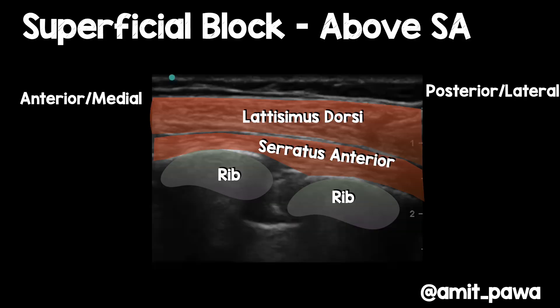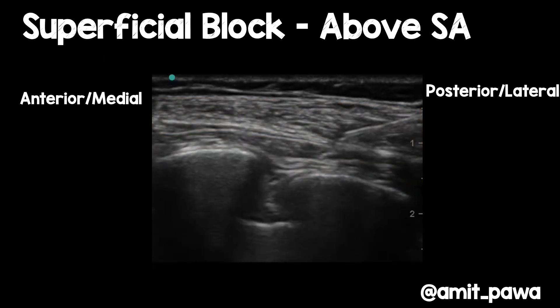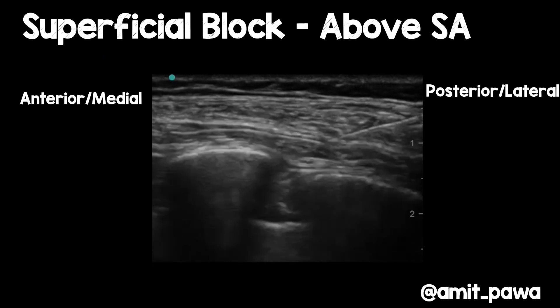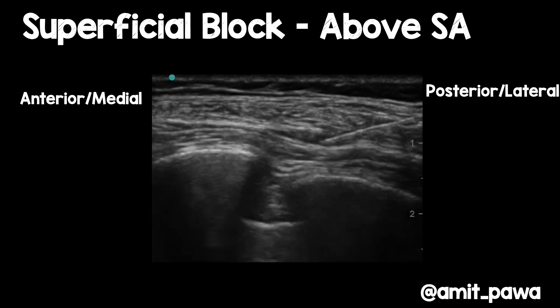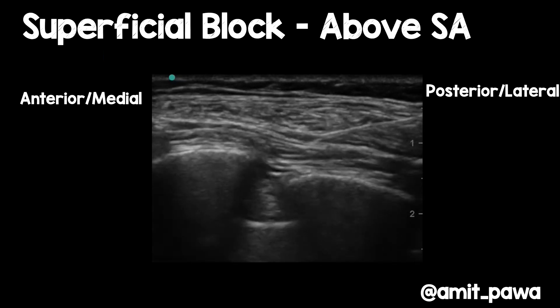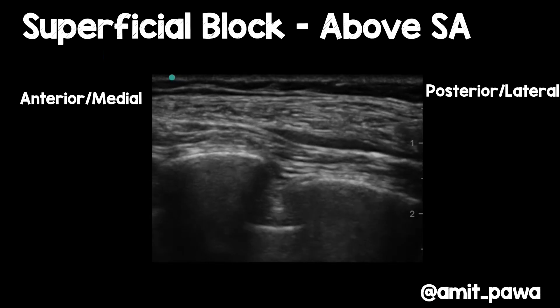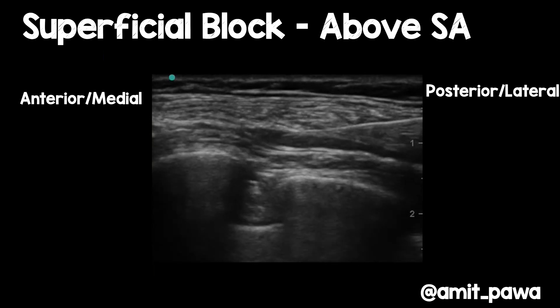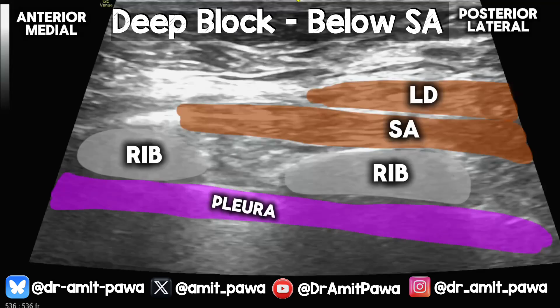Starting with the superficial approach — the patient is lying on their side, with the left-hand side of the screen being anterior and the right-hand side posterior. The needle is introduced from the posterior aspect, going through LD and popping into the gap between LD and serratus anterior. Inject local anesthetic and you see that lovely unzippering. The needle is advanced into that plane between latissimus dorsi and serratus anterior to open up that space. That's the superficial serratus anterior plane block.